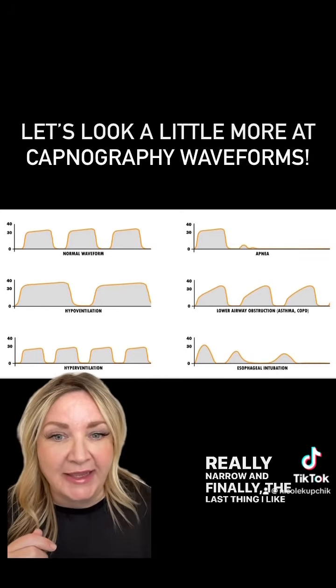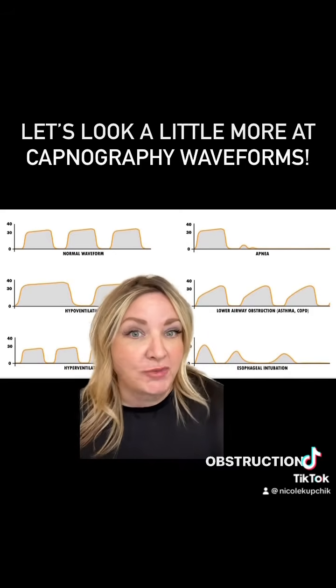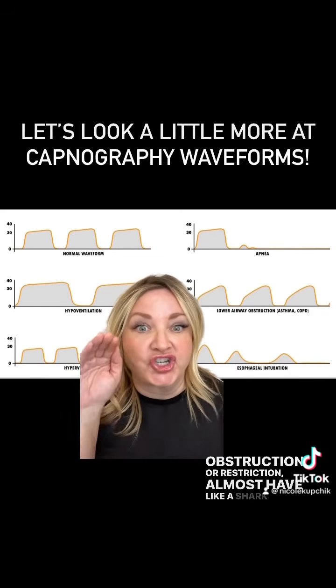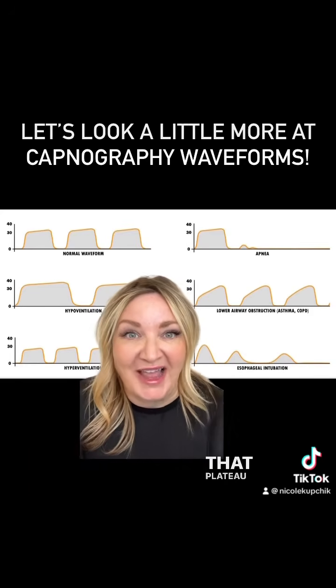And finally, the last thing I like to chat about quickly is in COPD or any patient who's got airway obstruction or restriction, you almost have like a shark fin type waveform. And as you give bronchodilators, you'll see that plateau off.